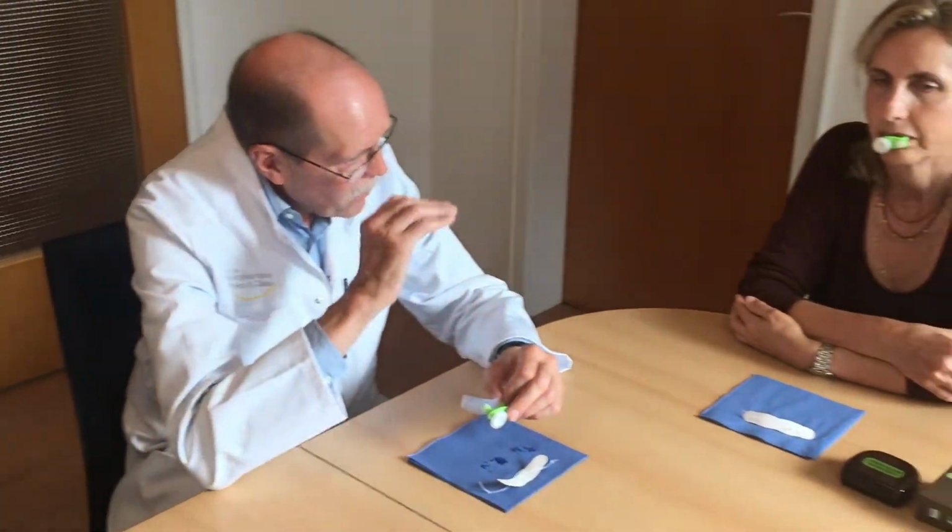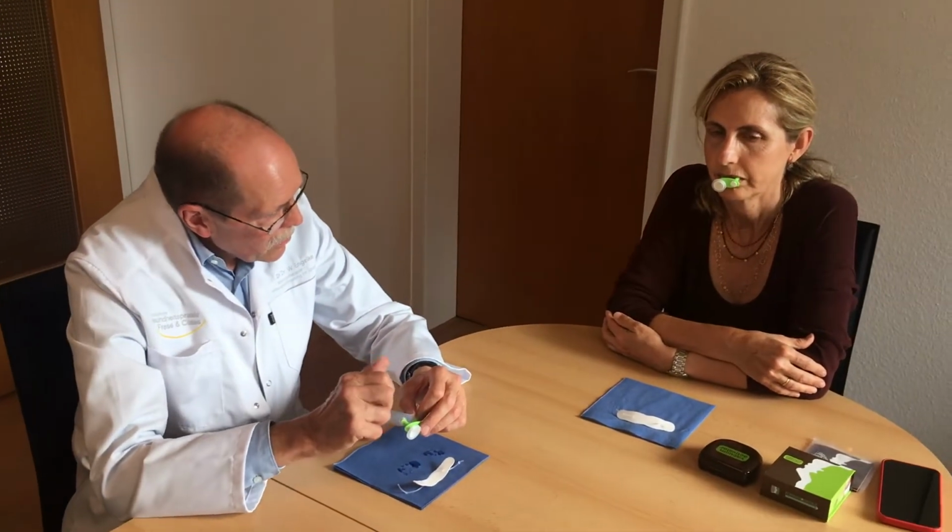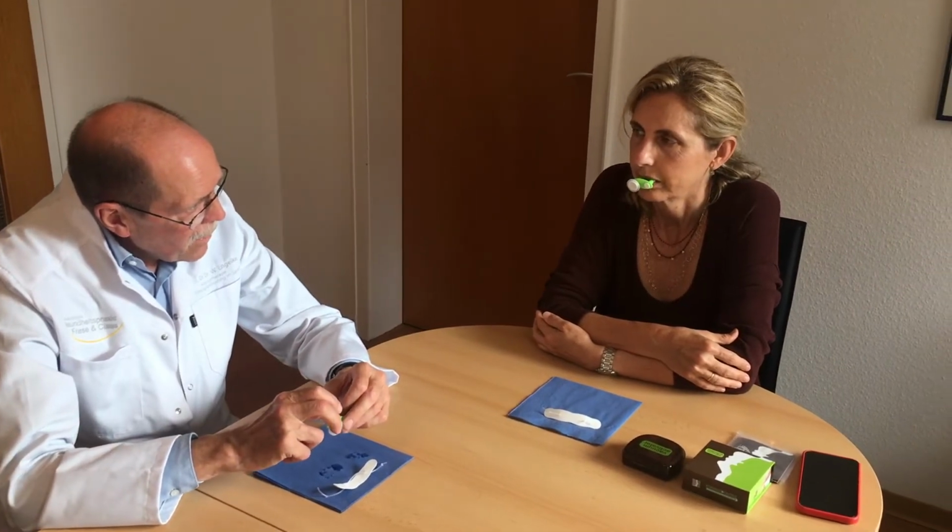Okay, please swallow and breathe quietly. Be so kind to swallow again and breathe quietly. Okay, as you can see, the membrane is slightly inverted, not with a very strong negative pressure, but slightly inverted, and this is sufficient to place the tongue into the position which is needed to maintain the upper tongue position and to close the three different valves of the mouth.